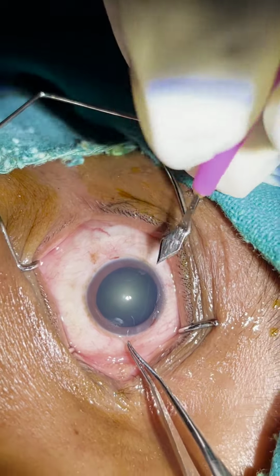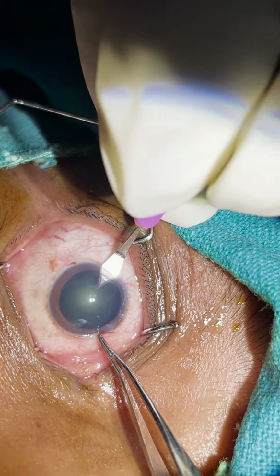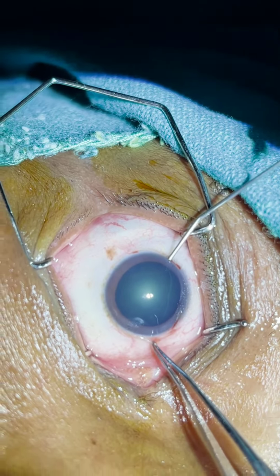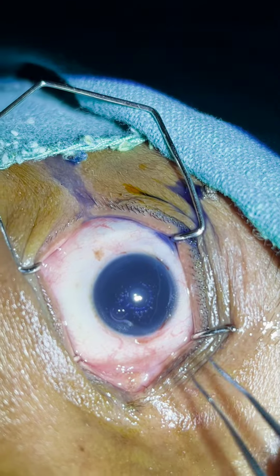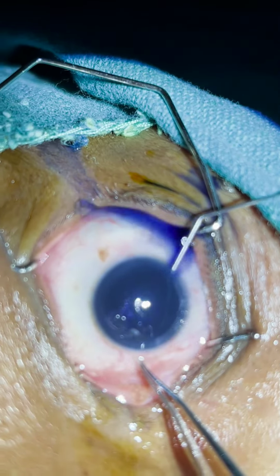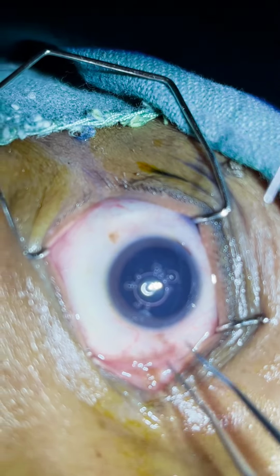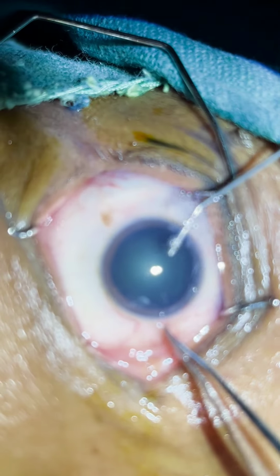I usually prefer a limbal incision over the clear corneal because it gives better healing, and the SIA will definitely be slightly lesser than with the clear corneal. Now I am washing out the trypan blue dye, giving this viscoelastic substance.